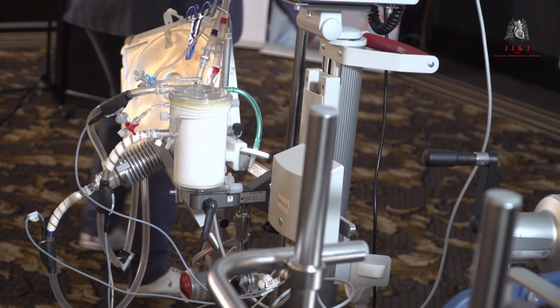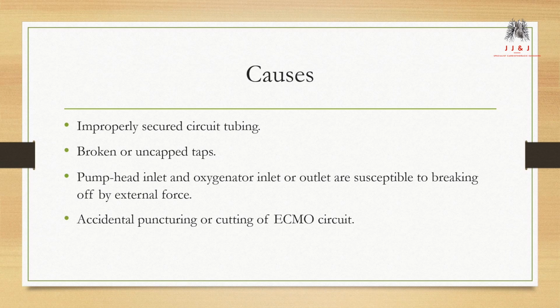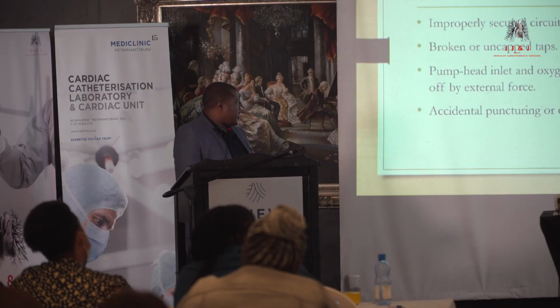Going back to the slide. The pump head inlet and the oxygenator inlet or outlet are susceptible to breakage by external force, of what I've just said now. And then there's accidental puncturing or cutting of the ECMO circuit.